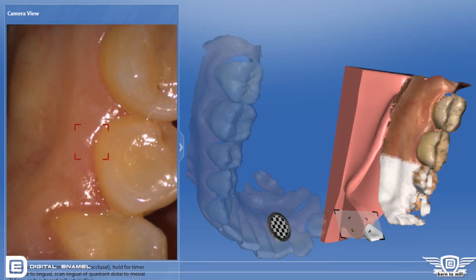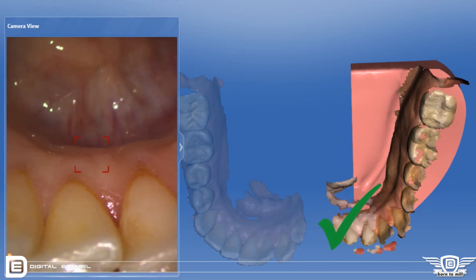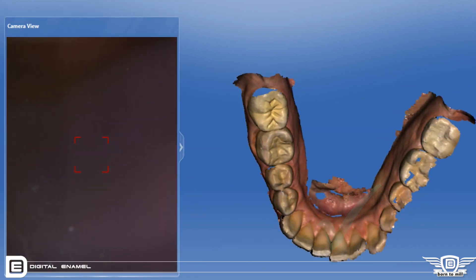Once that quadrant is completed, you move over to the next quadrant. As you cross the midline, it seamlessly stitches and gives you the full arch. You then move up to the maxillary arch and do the same thing.